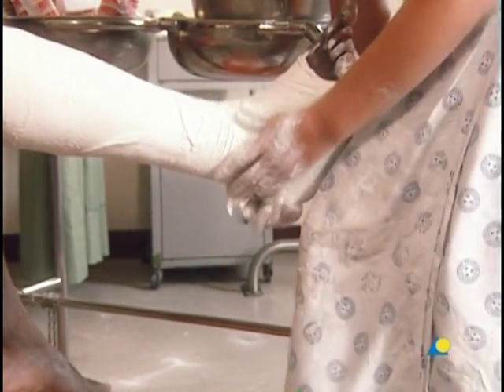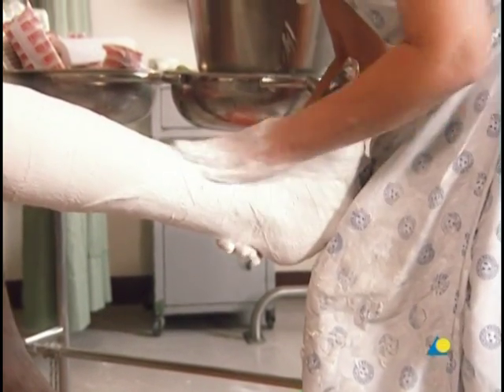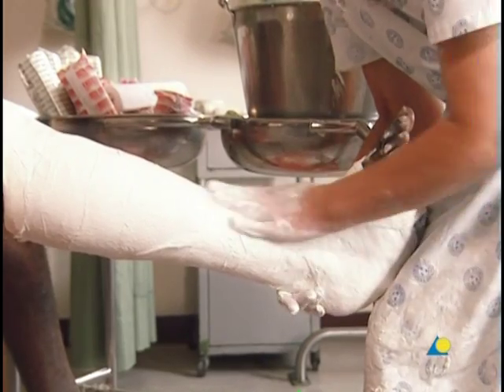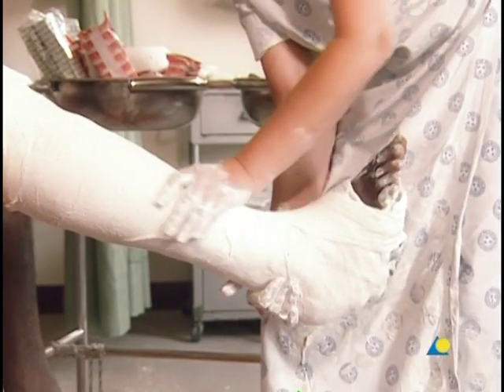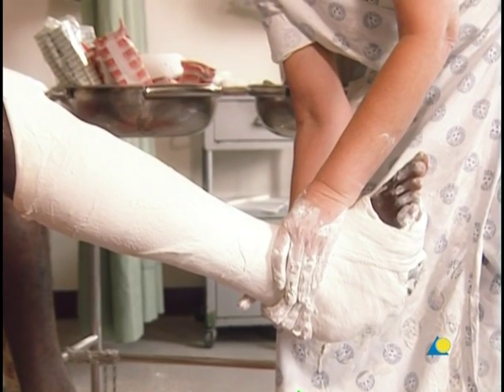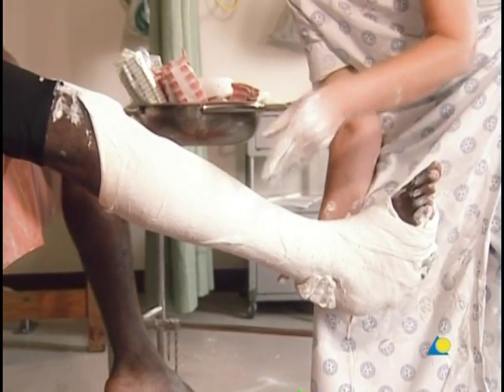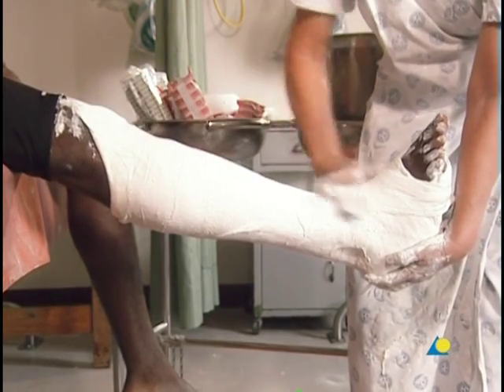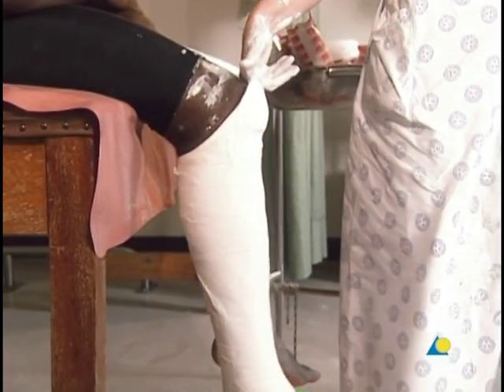The plaster is smoothed. The secure fit of the cast is verified by having the patient attempt to rotate the leg. A secure fitting cast will prevent rotation. Flexion at the knee is also checked; the patient should not be able to flex the knee more than 90 degrees.